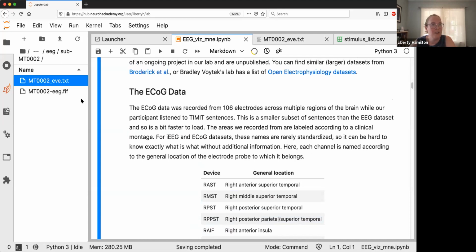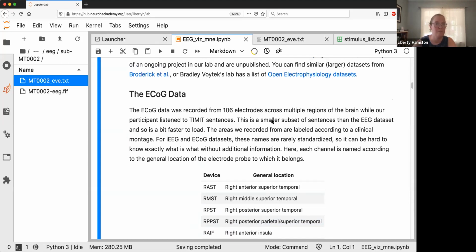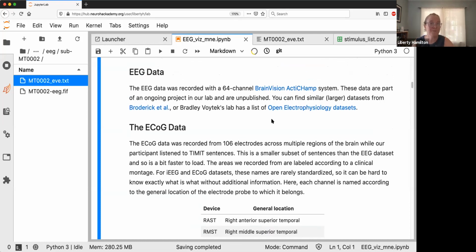Would you mind describing a little bit about the instrumentation and software used to collect the data, i.e. number of electrodes, event recording software, etc.? Yes, so I'm going to mark this as answering live. For the EEG data, we're using the Brain Vision ActiChamp system. We're actually using an old version of their software called Recorder.